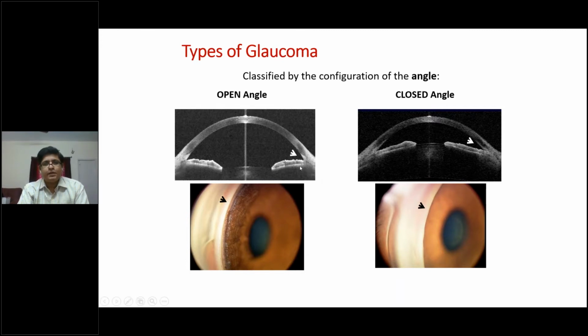You can't see the ciliary body past the iris-lens diaphragm, but you can get a very nice image of the angle, and it can be used as an initial opportunistic screening for patients who come to your clinic. Or when you have a problem deciding from gonioscopy, you can use it for confirmation. And that's how we can use the anterior segment OCT for angle closure.